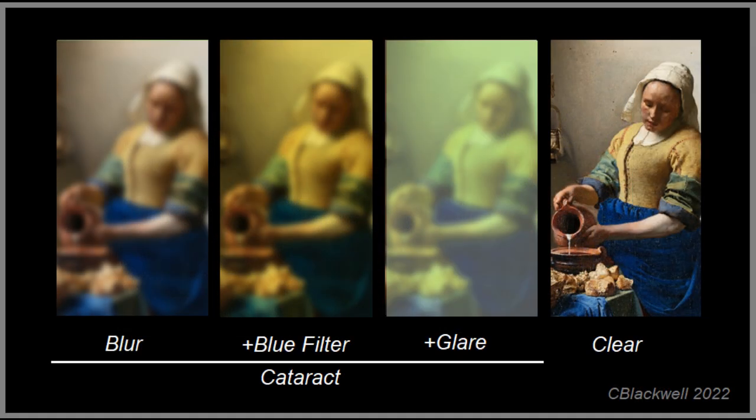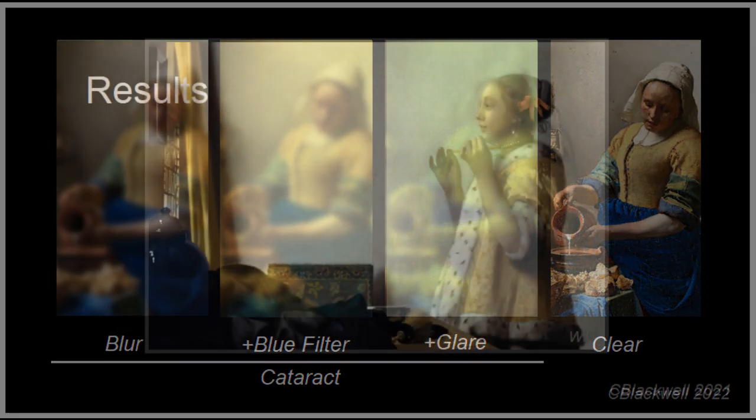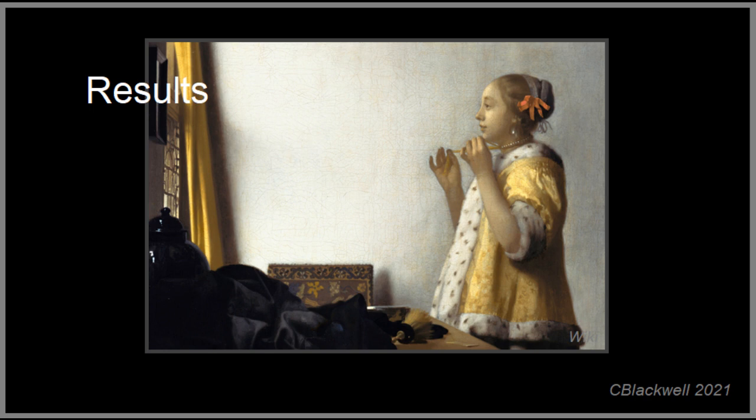After successful cataract surgery, patients will sometimes comment, "Yes, I see better, but everything is so blue." Or, "It made me older. I see so many wrinkles." Or, "I can't believe my house is so dusty." Or, "Who chose my clothes? Nothing matches."